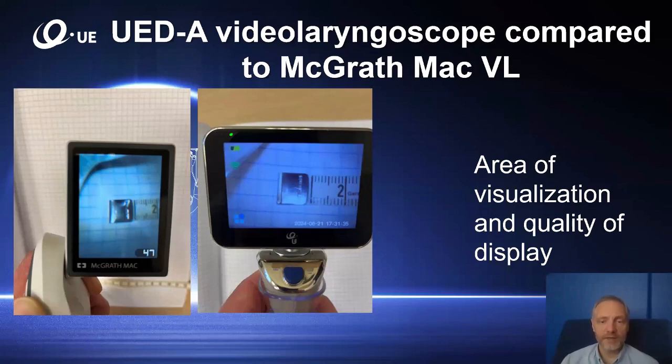Also, you can see some difference in the quality of display, and the details that can be shown and visualized by the UED video laryngoscope are definitely higher.